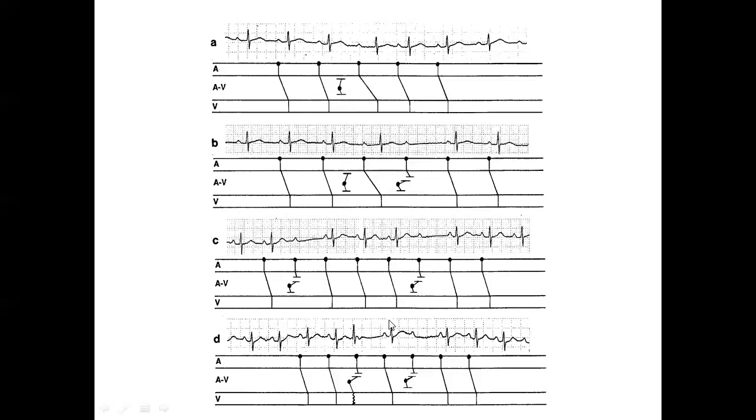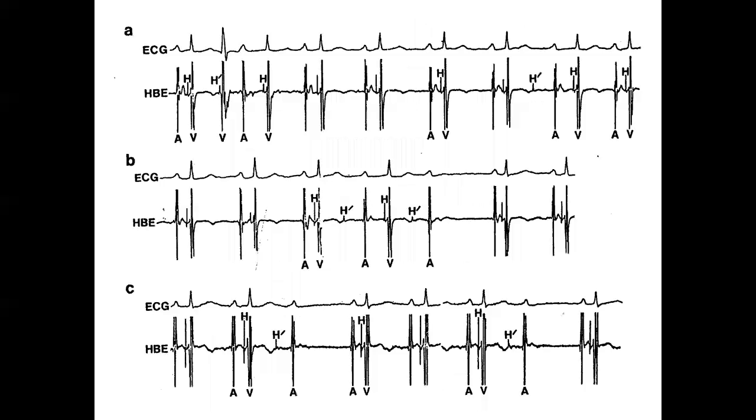And when I diagrammed it like that, nobody's going to buy it. You can say all you want, but I'm not going to buy it. So I had to have an EP person do an EP study. And indeed, when the PR lengthened, there was a junctional premature beat.